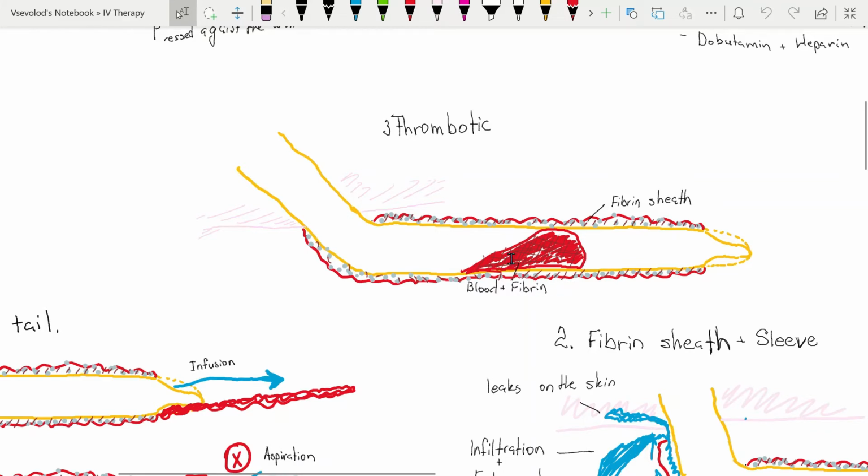Accumulation of deposits leads to obstruction of the infusion. Any artificial device placed in the body, including the central vascular access device, is coated with plasma proteins, blood cells, and fibrin. Through the coagulation cascade, the device is covered by a fibrin sheath as a protective mechanism.